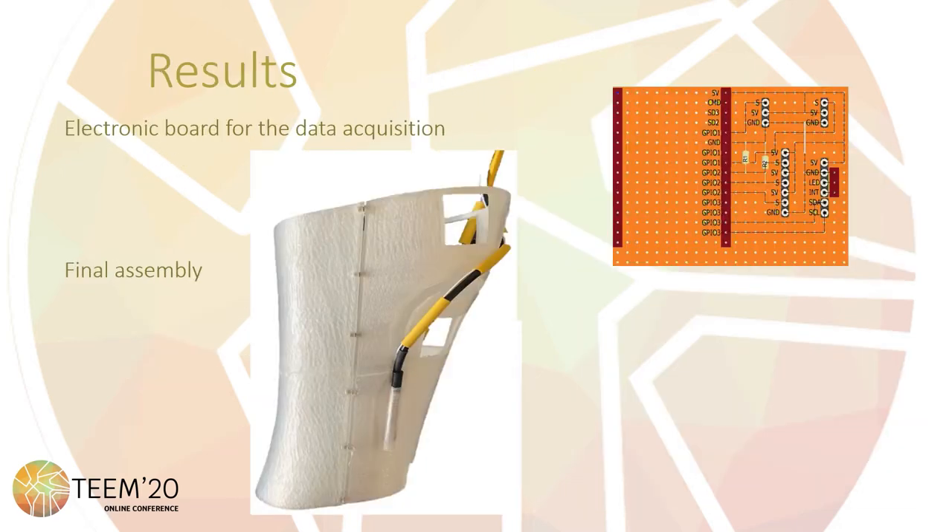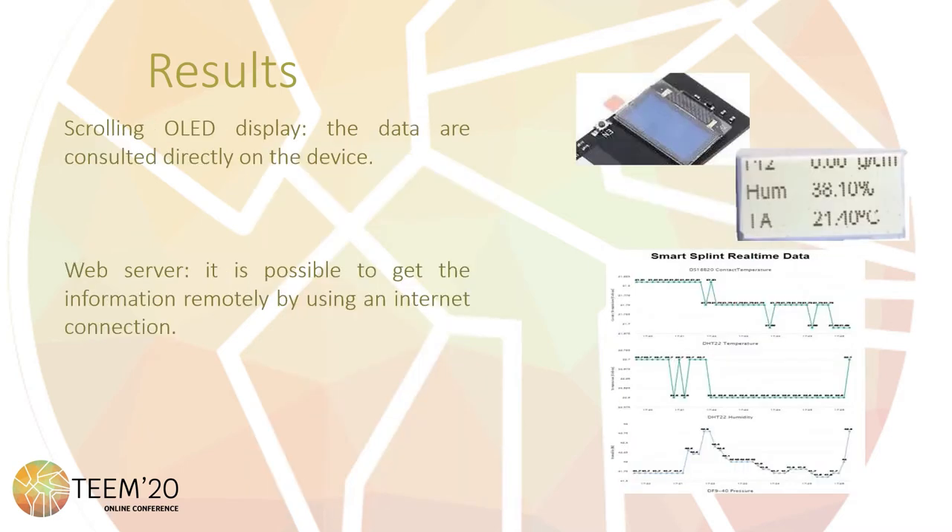In order to get the data from the sensors using the microcontroller, it is necessary to develop a small electronic PCB to connect everything needed. This board includes the connection for the controller, some electronic components, and the connection for the sensors. It is powered by a 5V battery. This electronic board is assembled with the sensors and the microcontroller in the manufactured splint. The acquired data can be consulted by scrolling through the display included on the electronic board, making the system completely autonomous. Also, this data can be consulted remotely using the observer included on the microcontroller — for example, a doctor is able to follow the treatment from anywhere in the world.